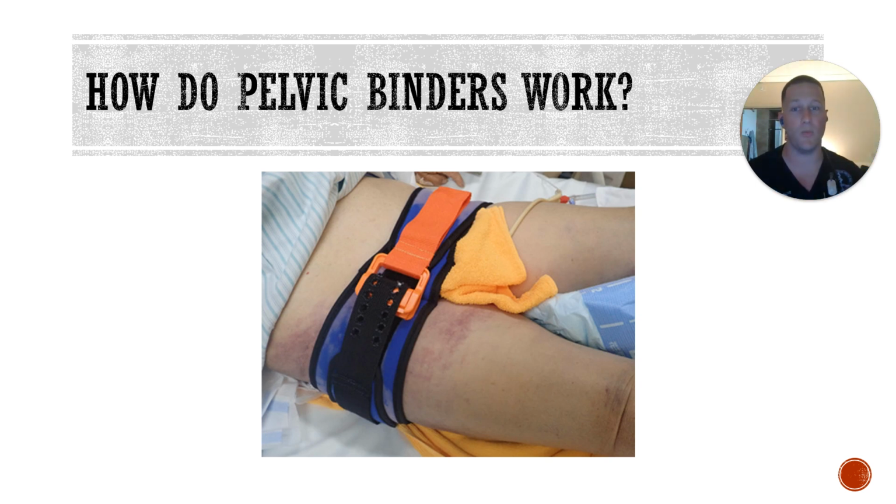Okay? Where do you put the pelvic binder? You put the pelvic binder on your greater trochanters. We can talk about that more in person, certainly. But it's not at your belly button. It's not where your belt goes. It's lower than that. If you put your hands on your hips, up where your iliac crests are, and then you go down to your femur, where your bone juts out just below your hip, that is where the pelvic binder should go. It essentially goes, like in this picture, right over your genitalia in the middle, and you can cinch it down.